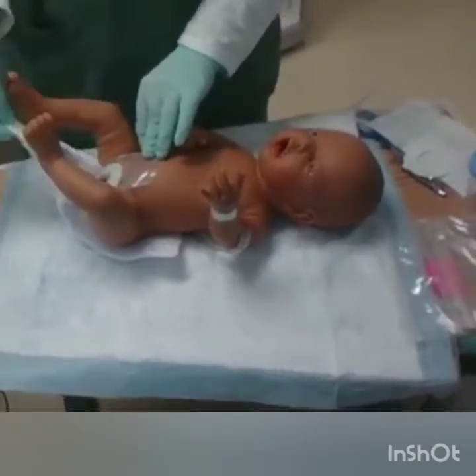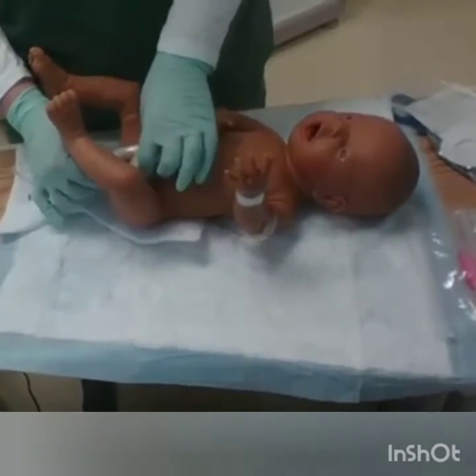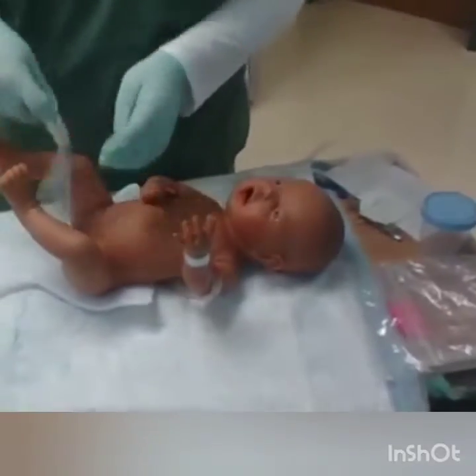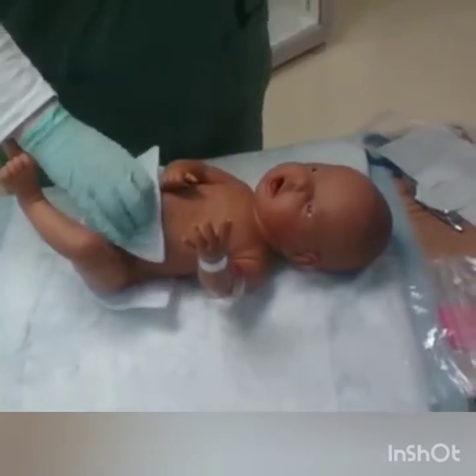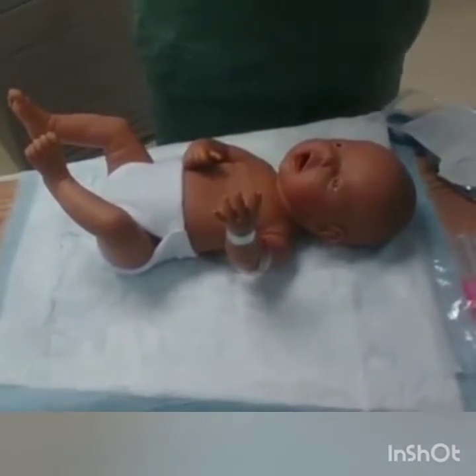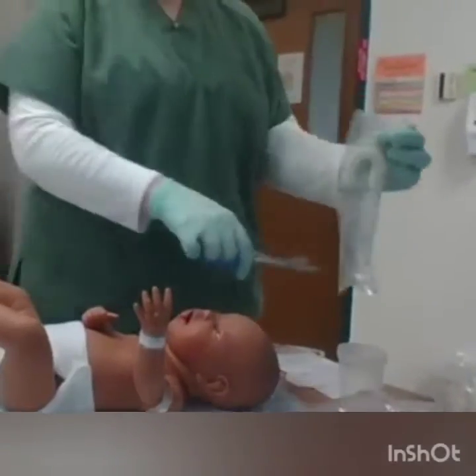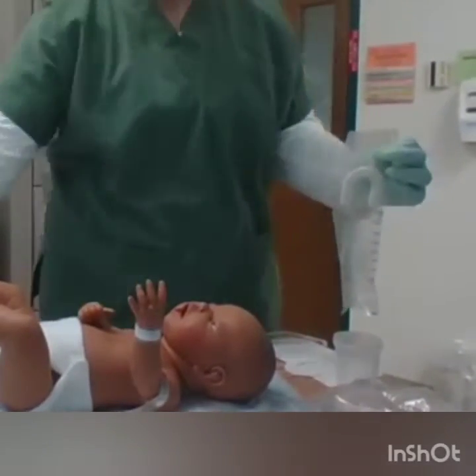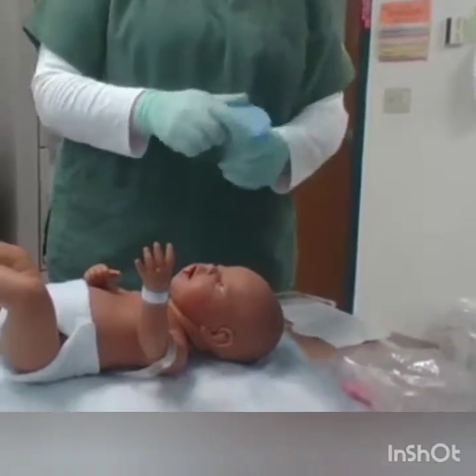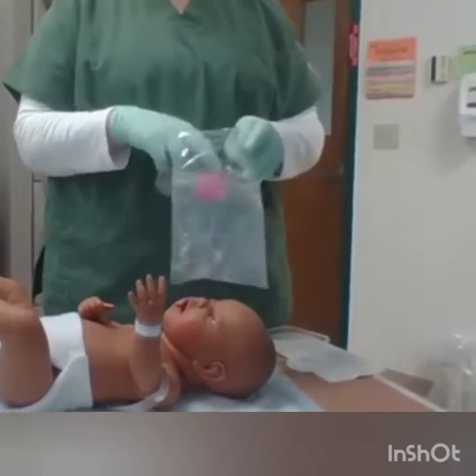Check the collector every 15 to 20 minutes. Remove the collector if already filled with urine and place a clean diaper on the child. Then pour the urine into the specimen container. Close it properly, label the container, double bag it, and then send it to the lab.